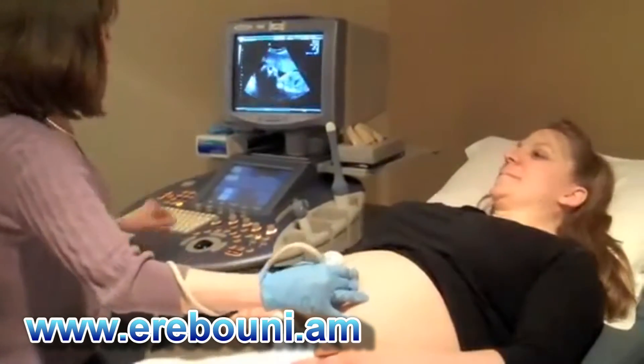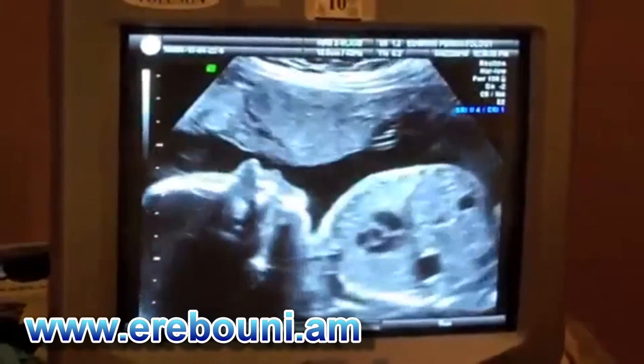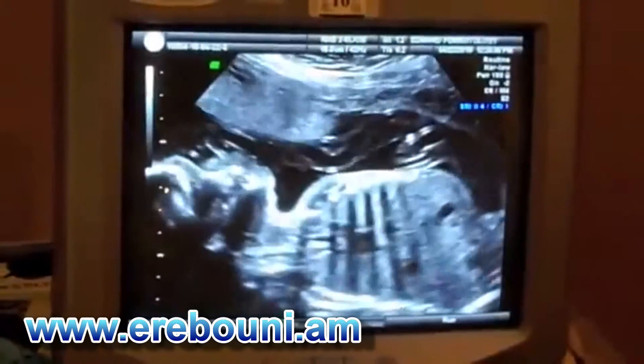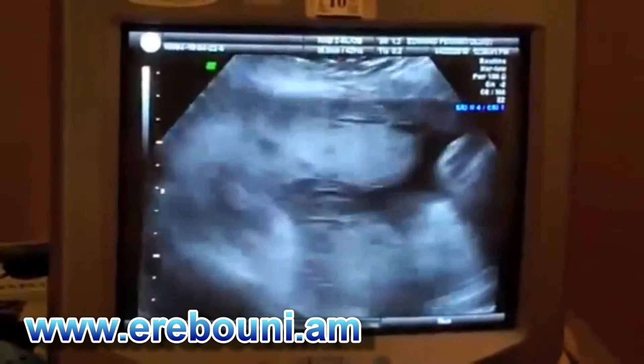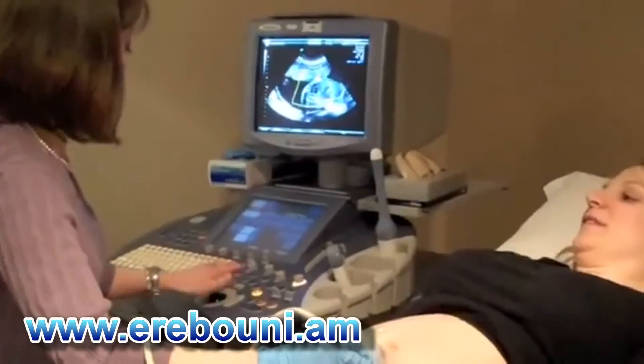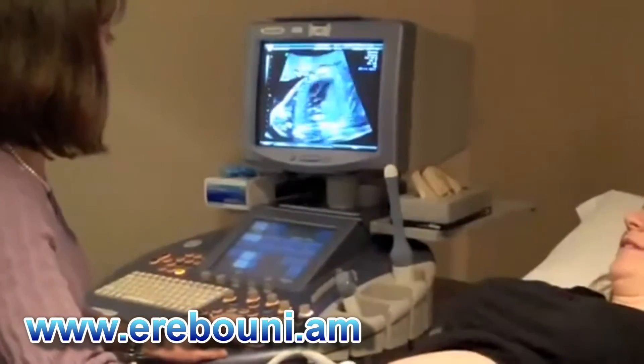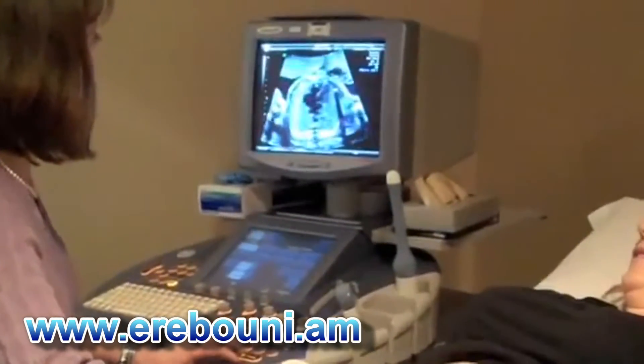In the first trimester, ultrasound is used to locate the pregnancy, see the number of fetuses and where they are located, as well as to date and check the health of the fetus.